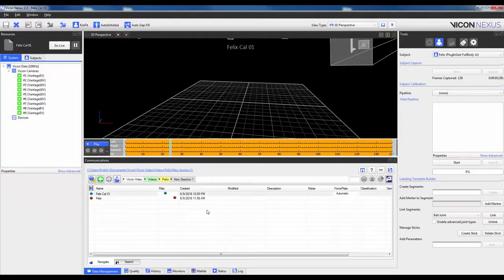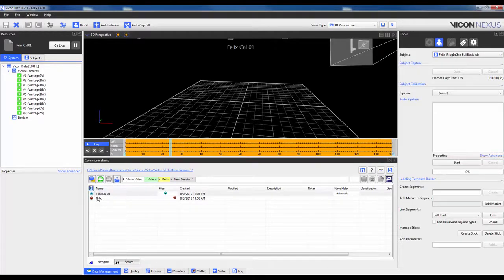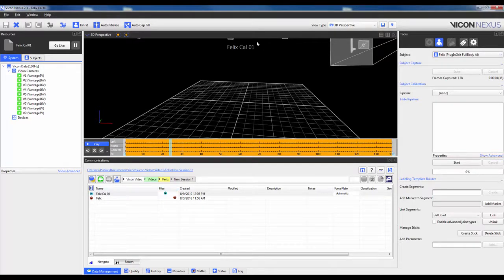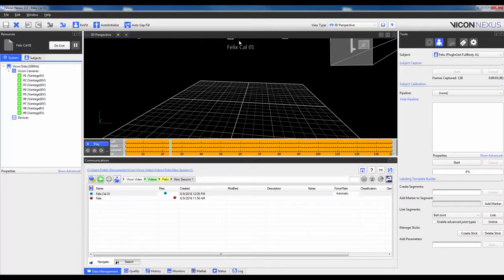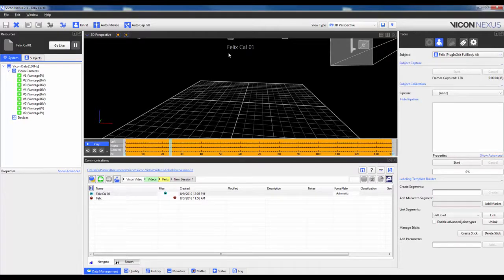You will see that as soon as I click Stop, the trial will actually appear in the Data Management and it has switched from the Live to the Trial View. It has opened automatically. This is verified up here at the top where it no longer says Live, but actually says the Trial FelixCal01. From here, you actually have to make a choice.